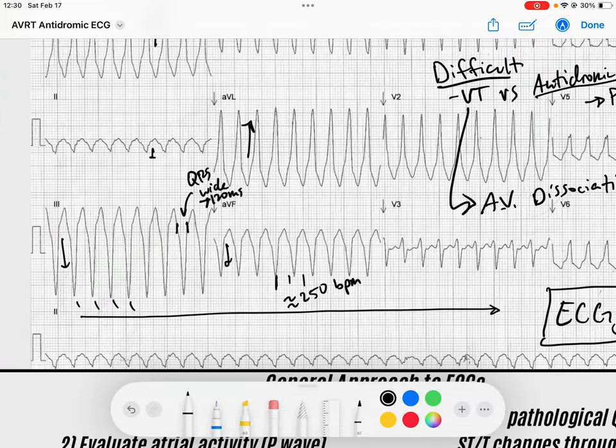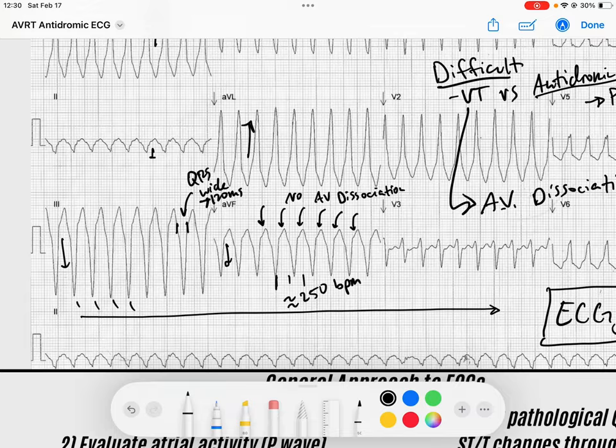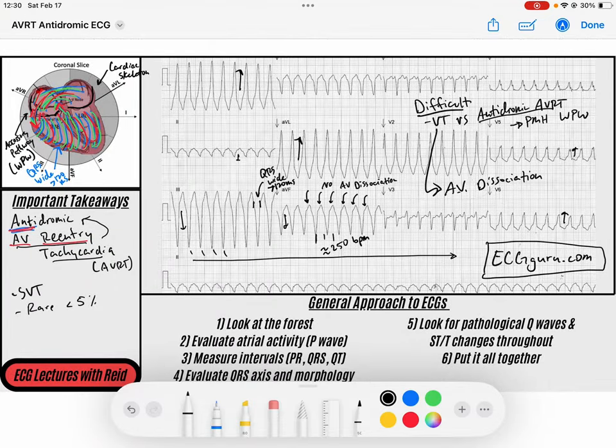But as I scan through, I look for AV dissociation. I look for P waves that are occurring on these ST segments. I'm looking for P waves that are occurring on the ST segments for AV dissociation. I don't see any. I see no AV dissociation. And so sometimes, like I said, these are really hard to discern. Sometimes you have to treat them like they are VT, and then later to find out that they are antidromic AV reentry tachycardia.